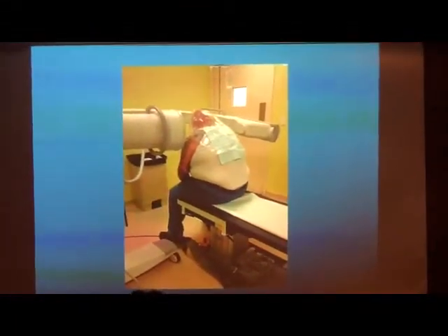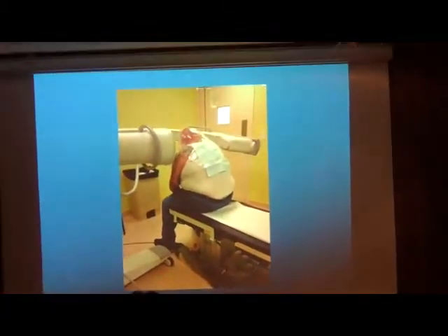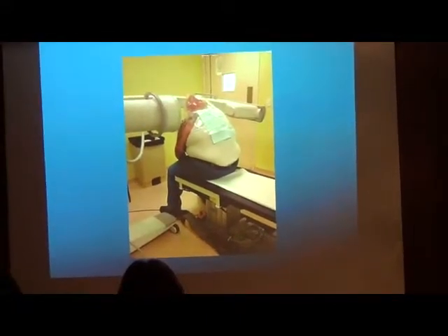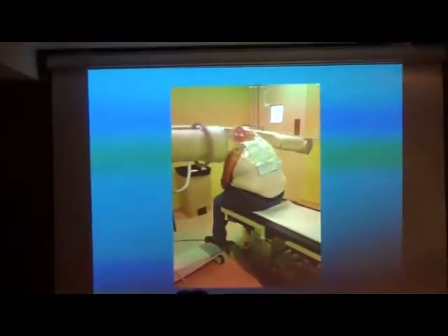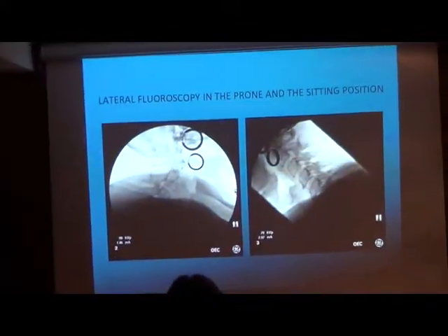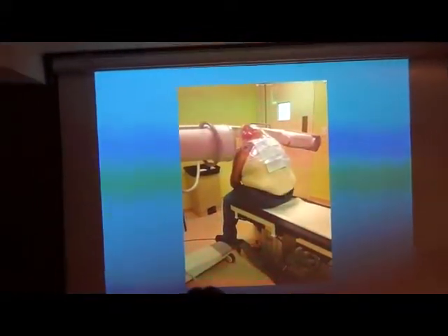You can see I don't look for easy patients. Imagine this patient in the prone position, stop breathing, and I have to turn him around. I will die together with him. Here I just remove the needle and I put him, oh, now it works. I just remove the needle and put him on the table.